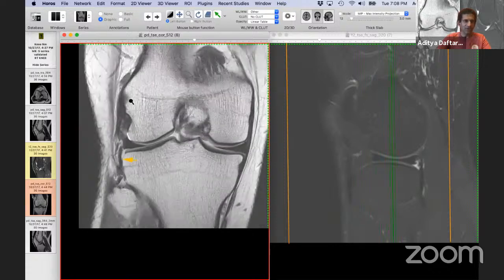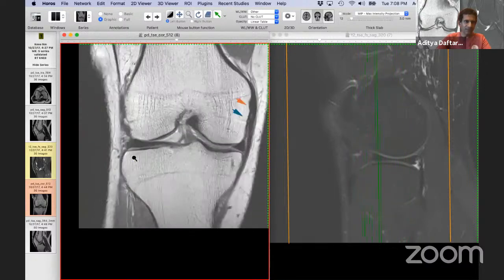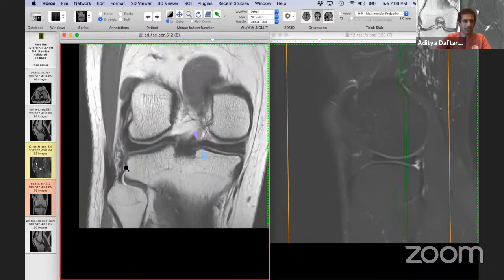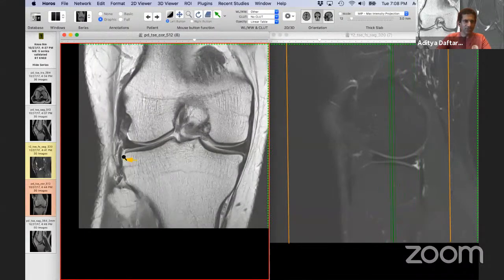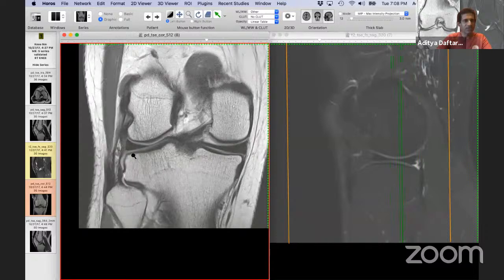As you go a little further behind, this little strand-like structure just behind the iliotibial band, as you come a little further back, is going to be the world famous anterolateral ligament. This is its tibial attachment, and this is the strandy thing that goes up here. I think this is a piece of bogus ligament, but I'll leave that for another day in discussion.